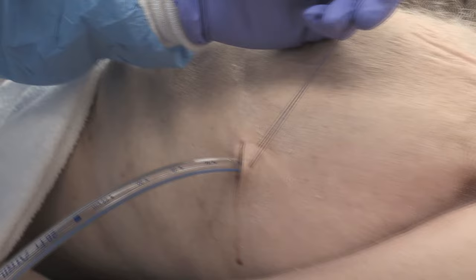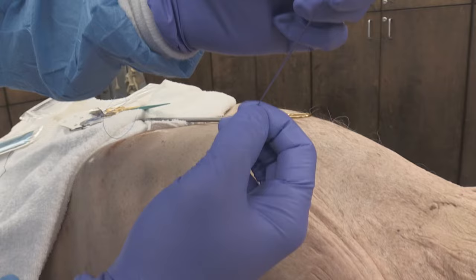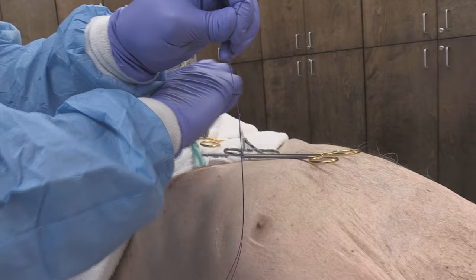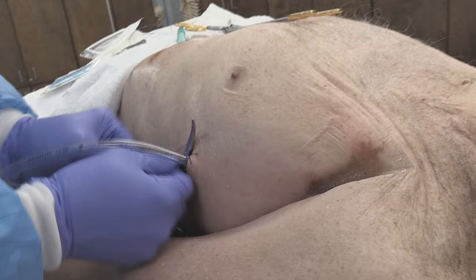Then I make one loop, one tie, bring it through, and so I have a knot. You'll see the single knot that secures both threads. I then take a small mosquito clamp, and this protrudes through on this side.